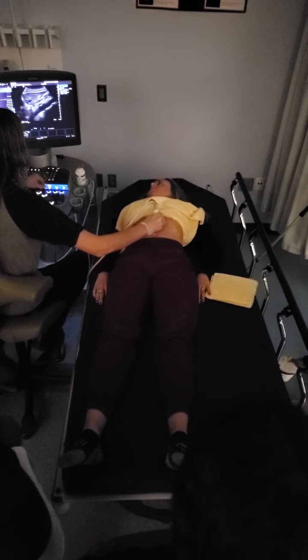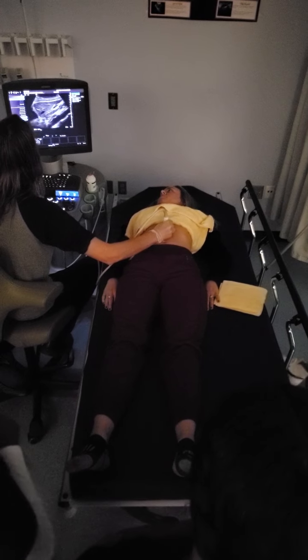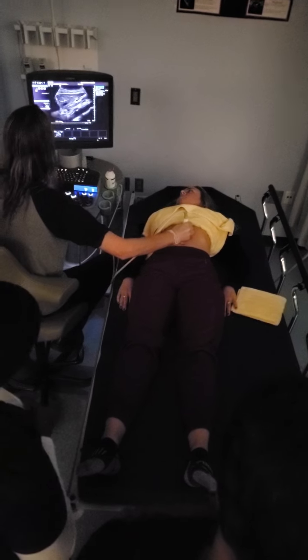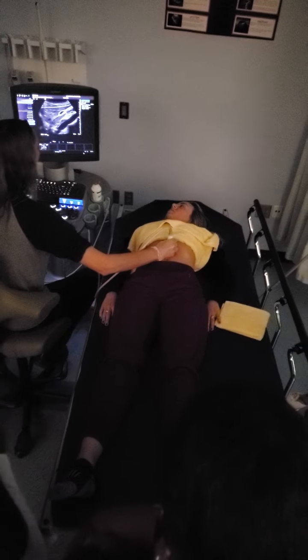Hold it. Okay, we've got a little bit of aorta. We may have to get rid of some of our depth. We'll call this mid. Now, do I need to take 2 images for this? No. Why not? Because you can see the borders. You got it. And then sliding out laterally again.